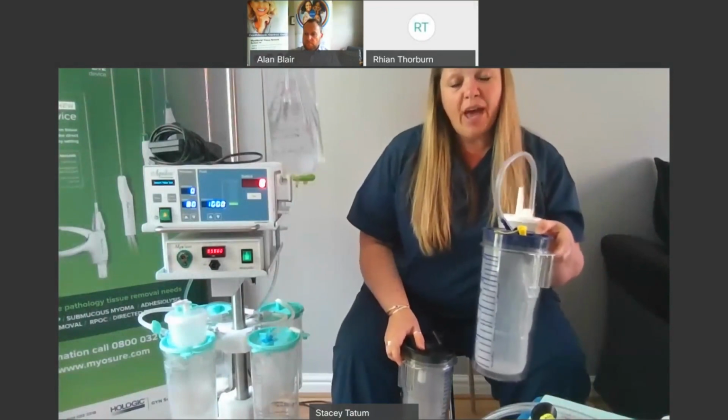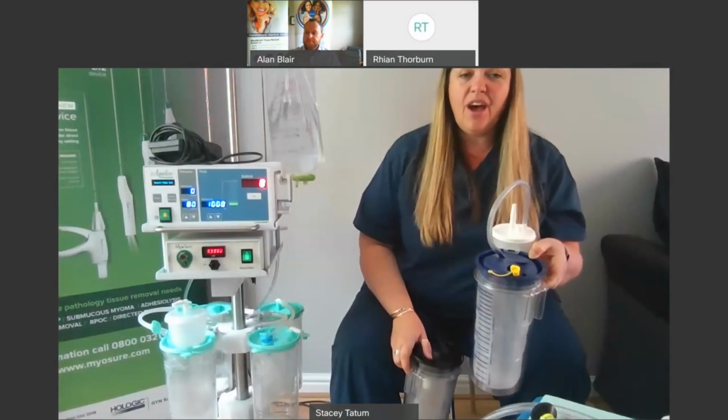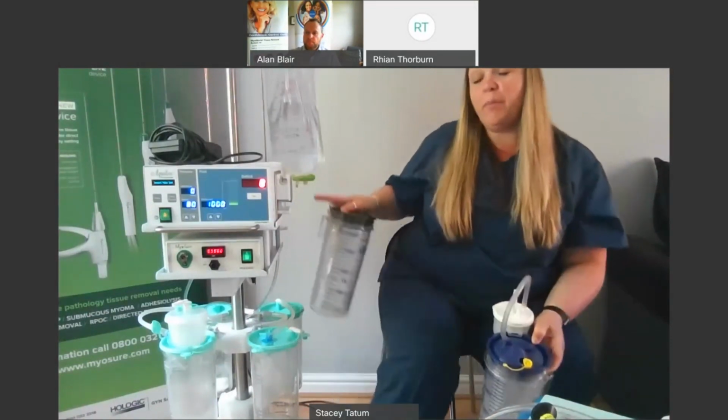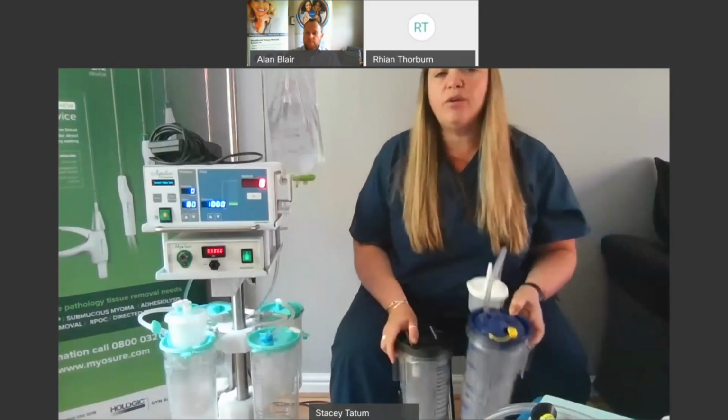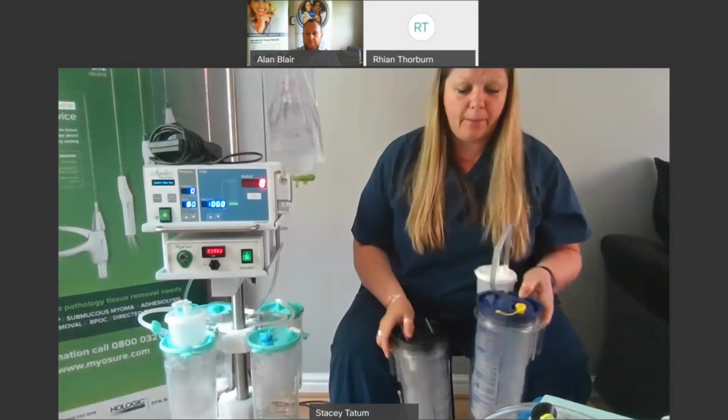If you haven't got any black canisters and you decide to use the blue ones, if you put a blue one at the back, this will not stop fluid going up into your machine, and it's going to ruin your machine. So please do not use the blue ones at the back.